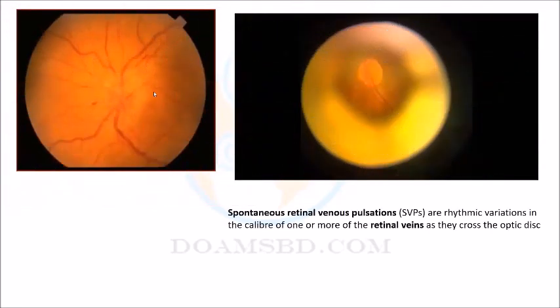Secondary optic atrophy. And I showed yesterday a live video in benign intracranial hypertension or idiopathic intracranial hypertension. Normally there is spontaneous vascular pulsation, sometimes it is visible, but in raised intracranial pressure, idiopathic intracranial pressure, the vascular pulsation is lost. I think, would you like to view it again or not? Dr. Farial, did you see it before the last day?